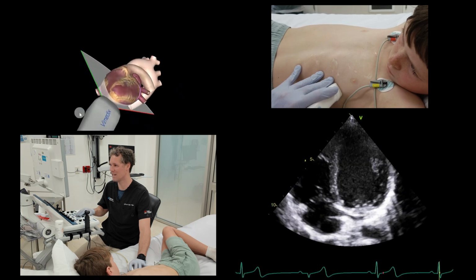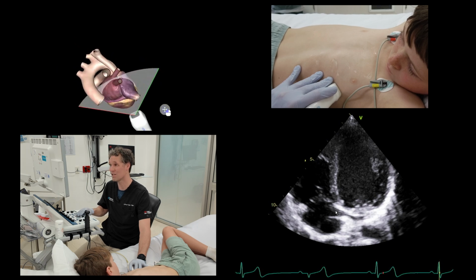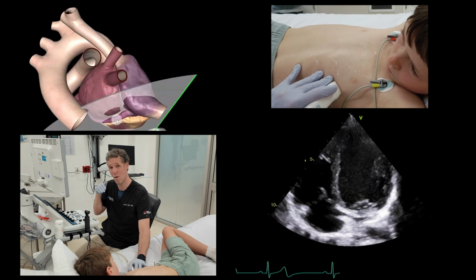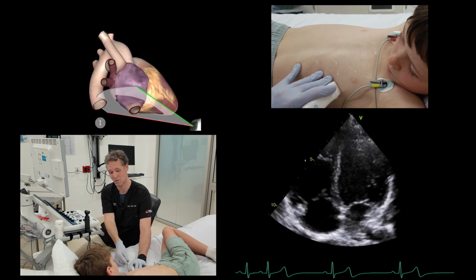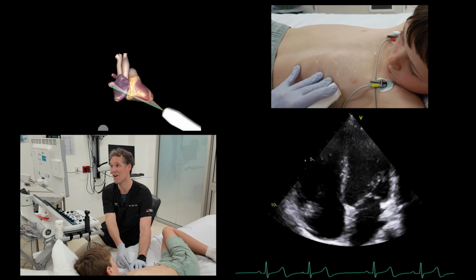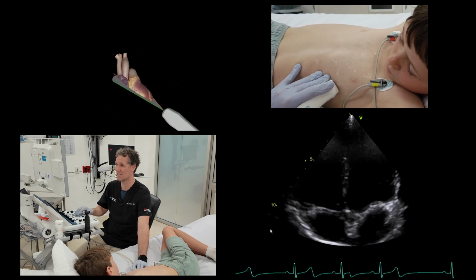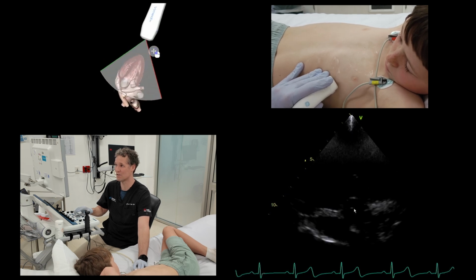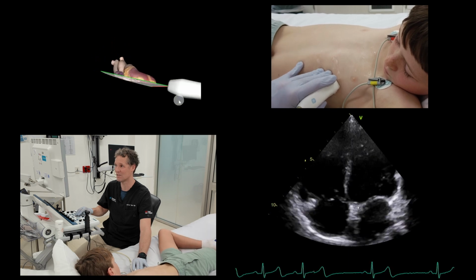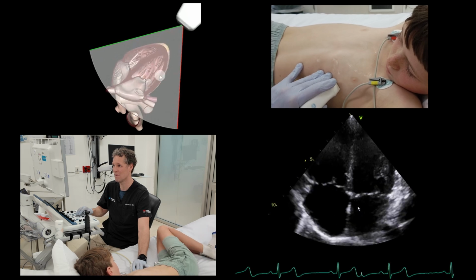Did you see this structure here? That's a black line that comes across the screen. That is the coronary sinus entering into the right atrium. Now that tells me that we're pointing too far posteriorly. And so what I'm going to want to do is then fan up. If I go too far, you can see the aortic valve starts to come in. And that's going to tell me that I've got to angle back to get rid of that structure. Okay? So there's our apical 4-chamber view.